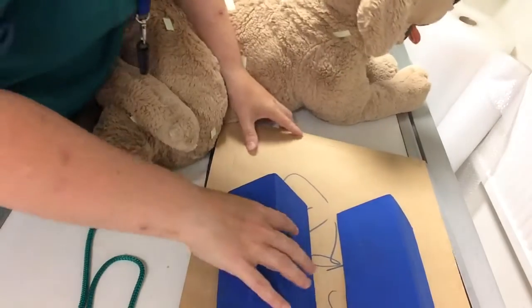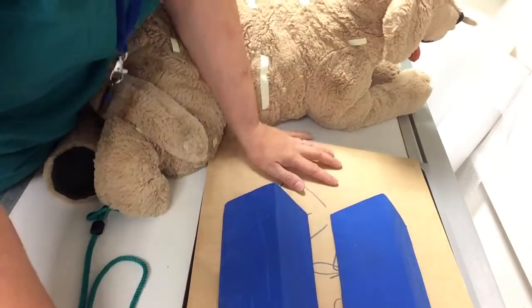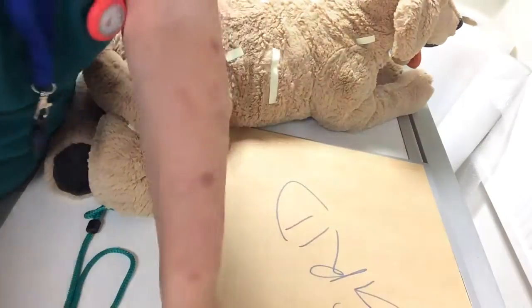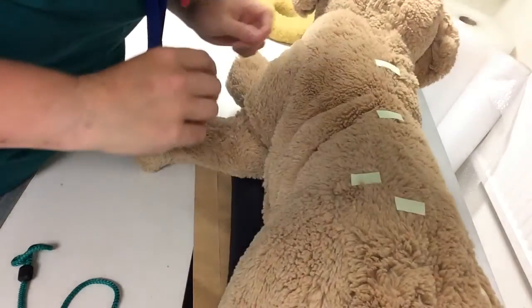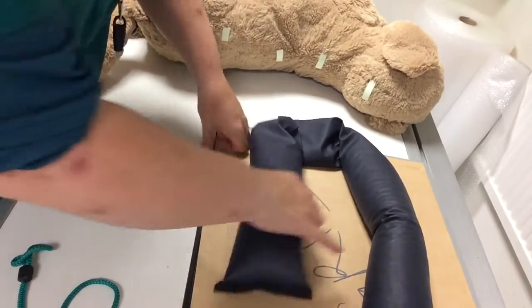I know that wedgies they say shouldn't show up, but they do. And also, how much have I altered the patient's conformation by pushing them into the wedgies? So I always think of a really bad boy band song: 'Please don't raise me up so I can sit on wedgies — don't raise me up on wedgies and sandbags too.' Sorry for the singing, but it's to get the point across — it's really quite annoying.